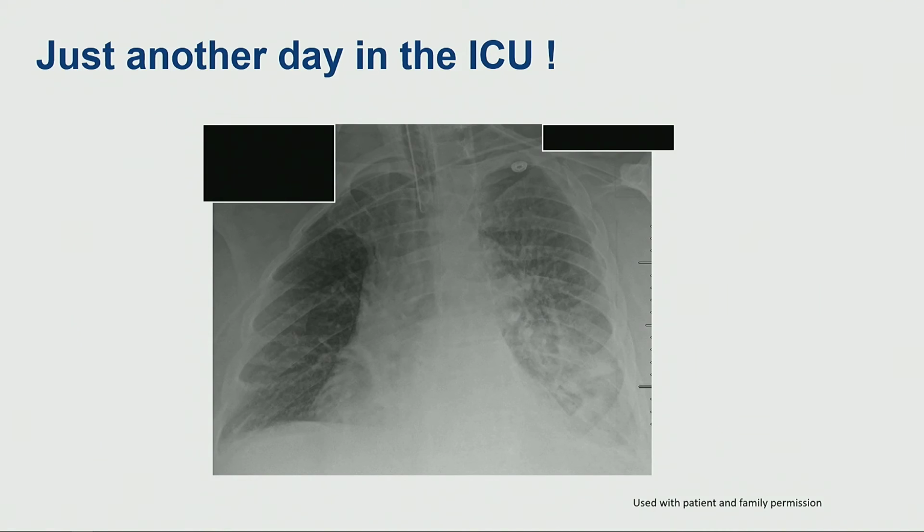This patient came to us for consideration for ECMO. Patient had a fairly high BMI, about 50. At this stage, you see the patient's intubated. This is the baseline chest X-ray here. So we cannulate the patient for ECMO.